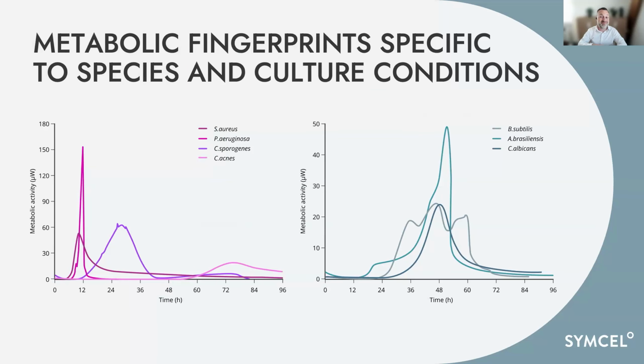And we can do that for more or less every microbe that we have tested. They will come up in different ways, but as we are only interested in detecting them reaching a certain threshold of exponential metabolism, we can detect this very, very fast.